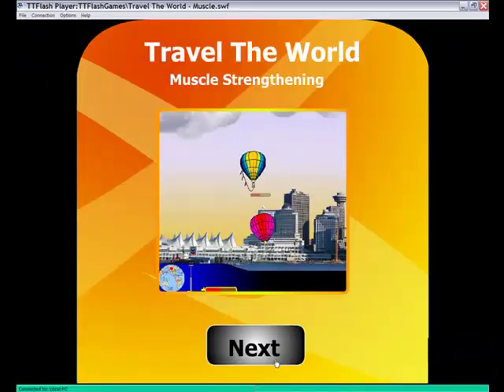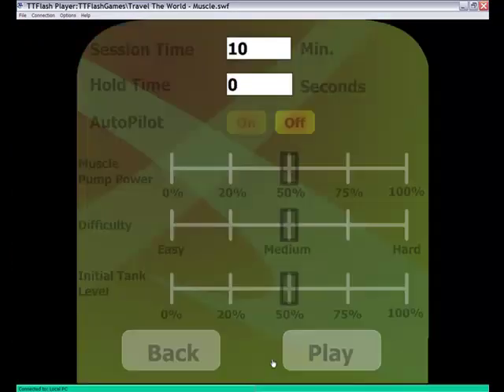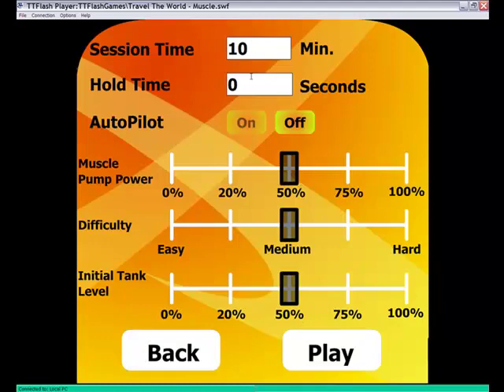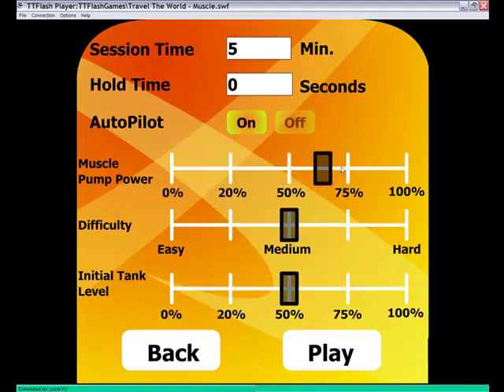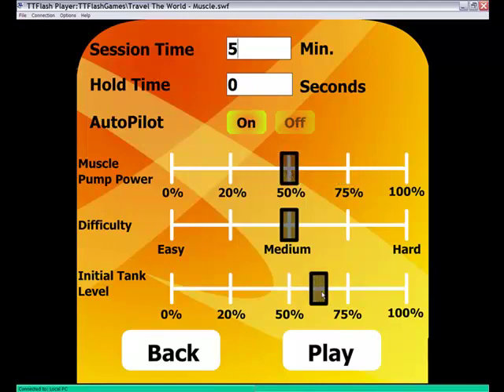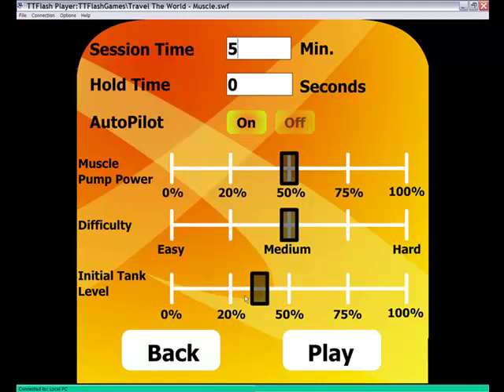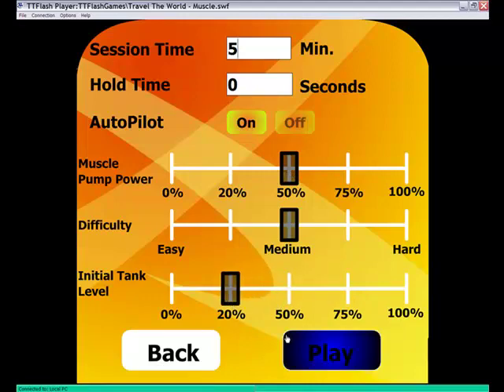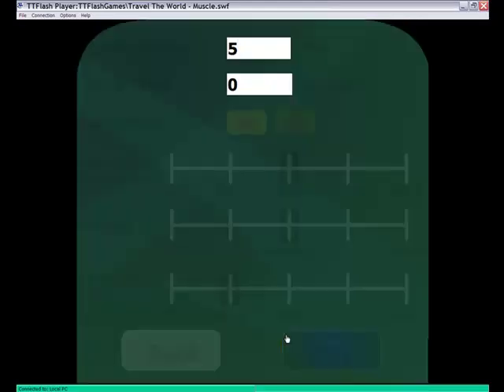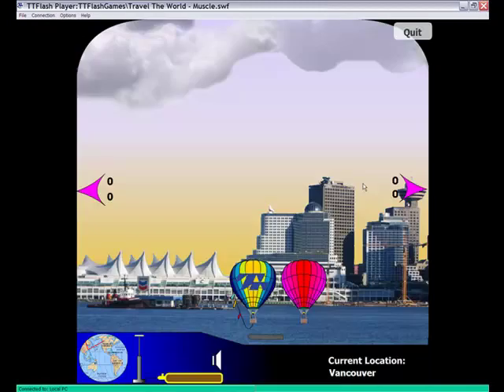Let's start the game now. Press Next. Let's see the different settings we have. Session time - I'm going to put 5 minutes. Hold time. Auto-pilot if you don't want to use the keyboard. And a few different settings to adjust the level of difficulty of the game depending on the muscle you're using and your condition. Press Play.